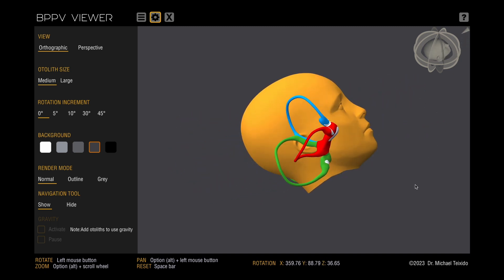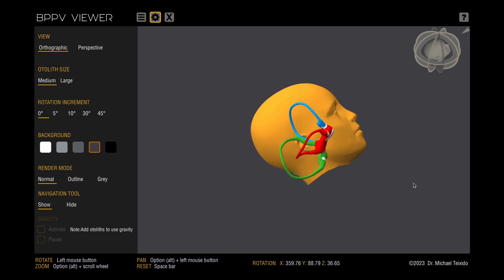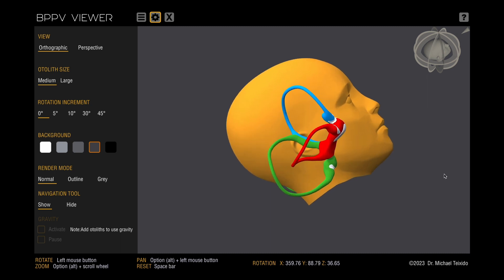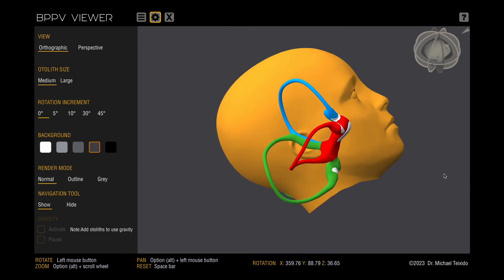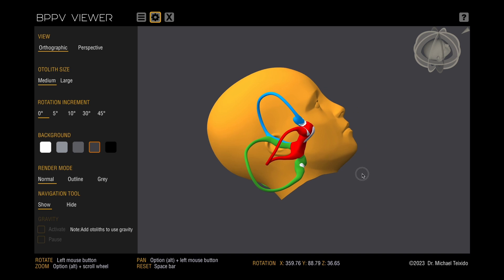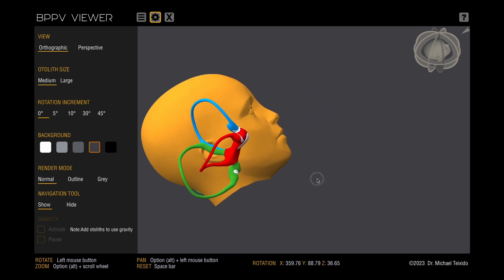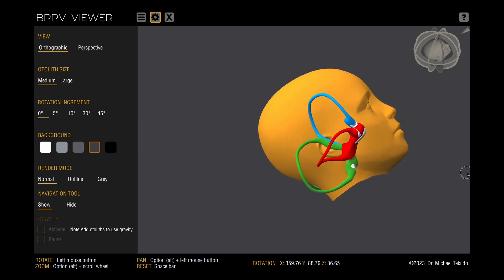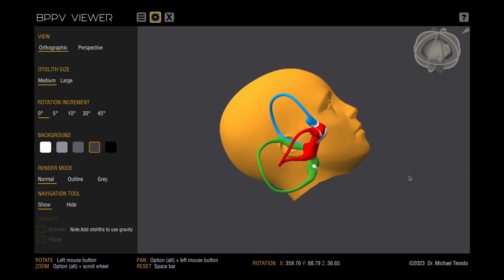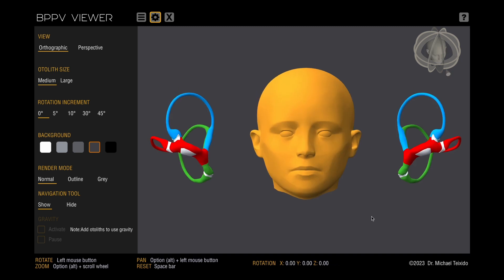For zooming in or out, hold down the Option or Alt key and use the mouse scroll wheel. To pan, hold the Option or Alt key and move the mouse. You can select your preferred view, either orthographic or perspective.